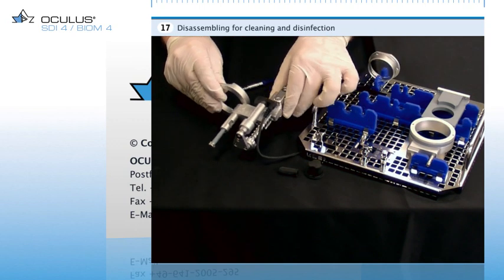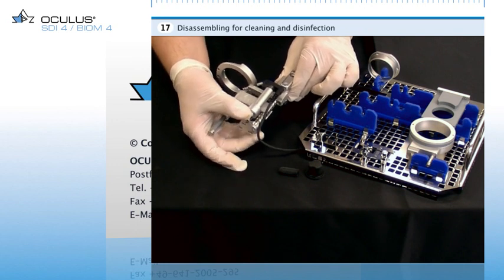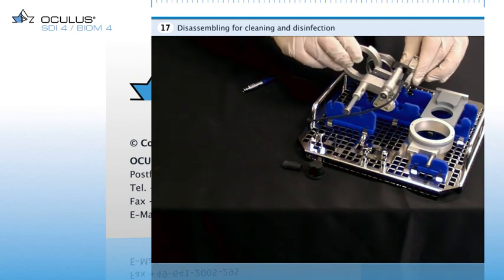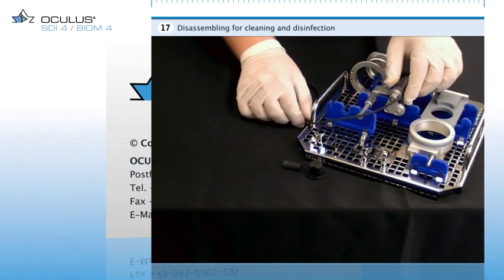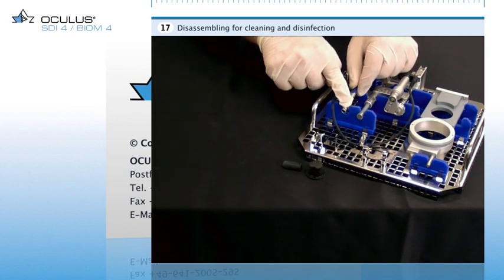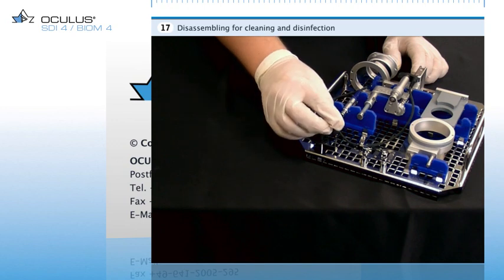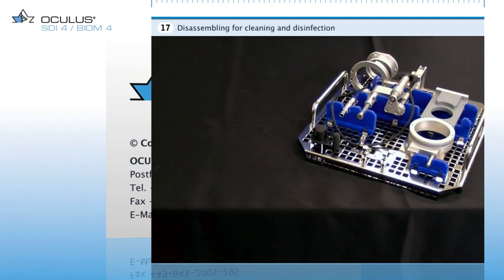For putting the Biome into the sterilization container, first reduce its length by turning the focus adjustment wheel so that the instrument fits onto its mount on the sterile insert. Then place the drive cable in its designated holders so that it is loosely held. The sterilizable covering caps of the SDI and the knurled screw also go on their designated mounts. Now all sterilizable Biome components are ready for automated mechanical cleaning in the washer.